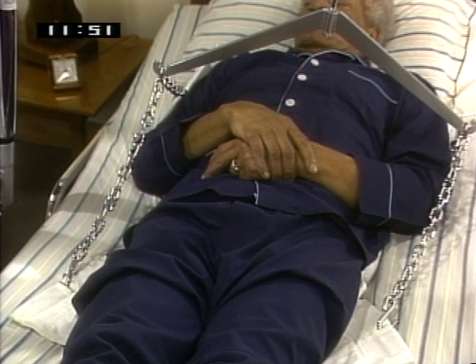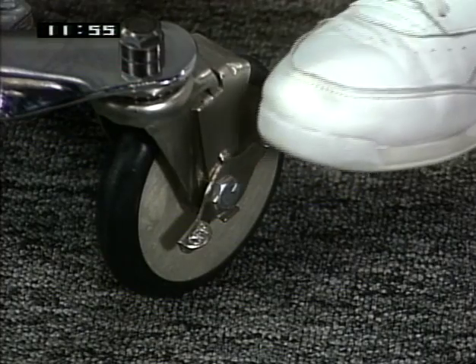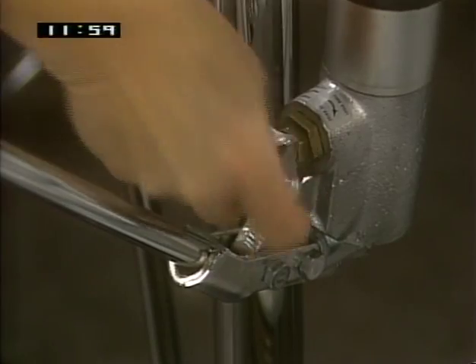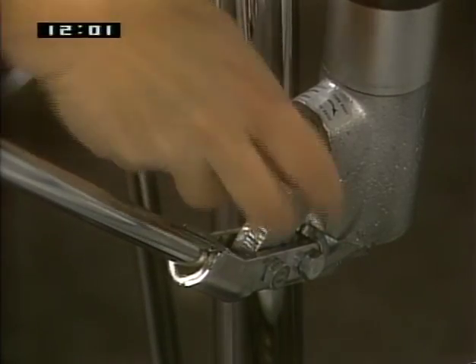Encourage the patient to cross his arms over his chest. Now you're ready to lift the patient. Be sure that the caster brakes are on and the hydraulic release knob is closed. Turn the knob clockwise to close.